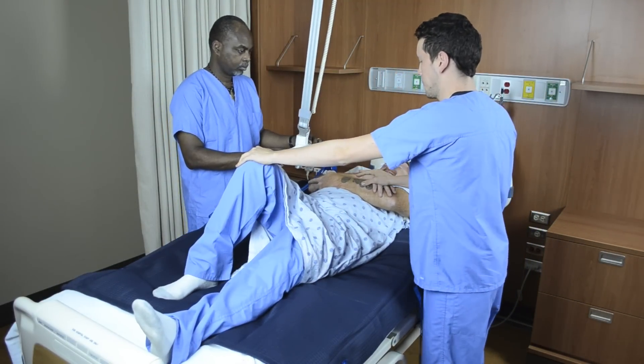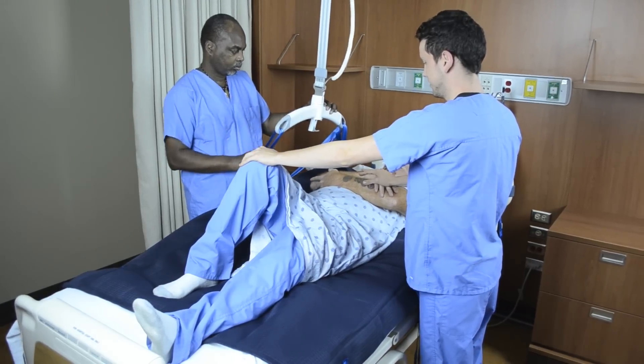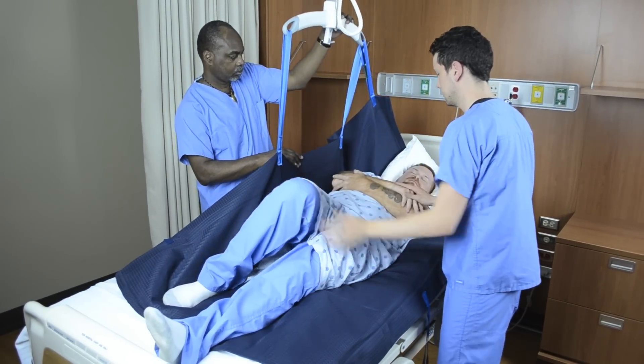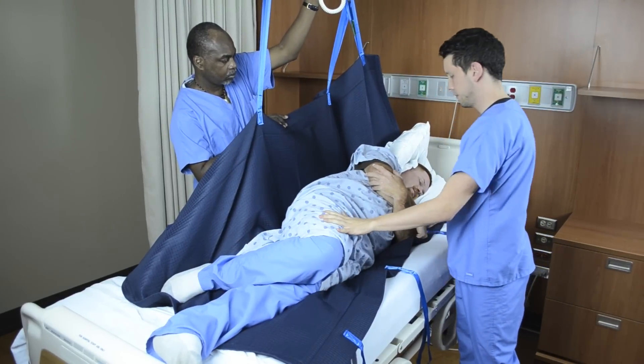As you raise the lift, the patient will turn onto the side not attached to the carry bar. As the patient rotates on the mattress, you may gently push on the shoulder and hip to assist turning, while at the same time keeping the patient centered in the bed.